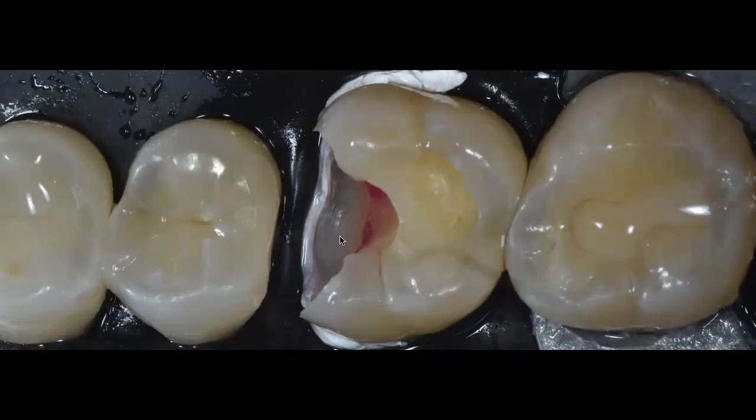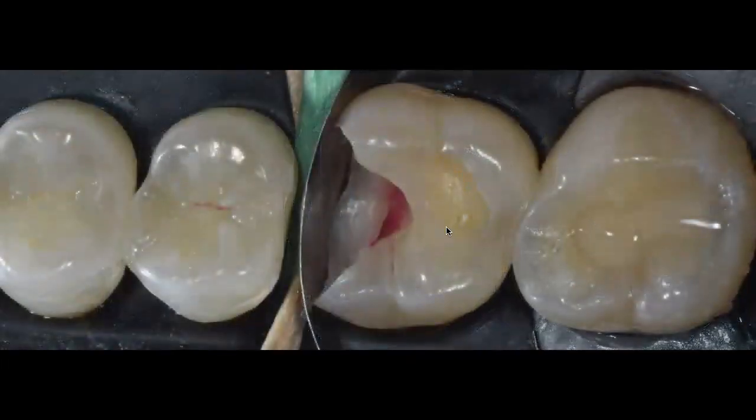I have a deep central safe zone that is still stained with light stain from the caries detection dye, which means there's still affected and even a little bit of infected dentin in that area that I'm leaving just because I am too deep into that axial wall. I'm more than 3 millimeters from the marginal ridge of the adjacent tooth.